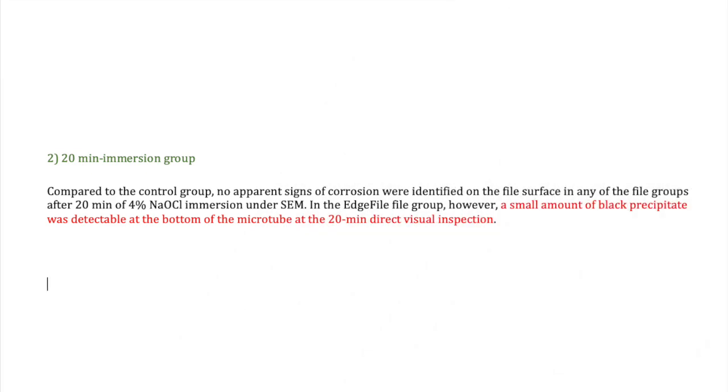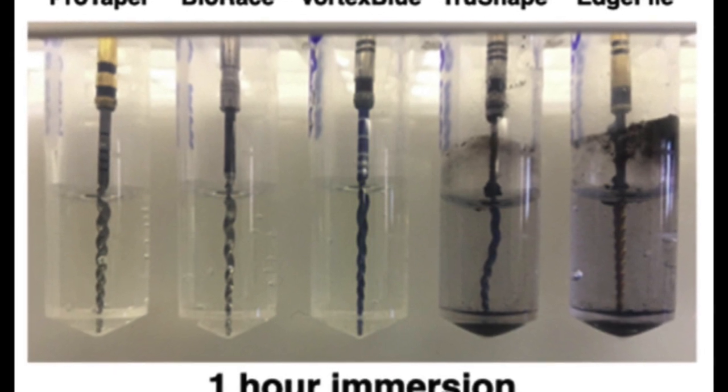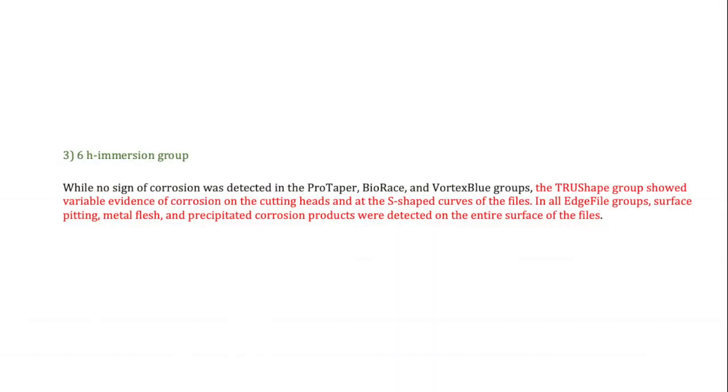For the 20-minute immersion group, a small amount of black precipitate was detectable at the bottom of the microtube at the 20-minute direct visual inspection of Edge File X7. For the 6-hour immersion group, while no sign of corrosion was detected on the ProTaper, BioRace, and Vortex Blue, the TrueShape group showed variable evidence of corrosion on the cutting head and at the S-shaped curve of the files. In all Edge File groups, surface pitting, metal flakes, and precipitate corrosion products were detected on the entire surface of the file.